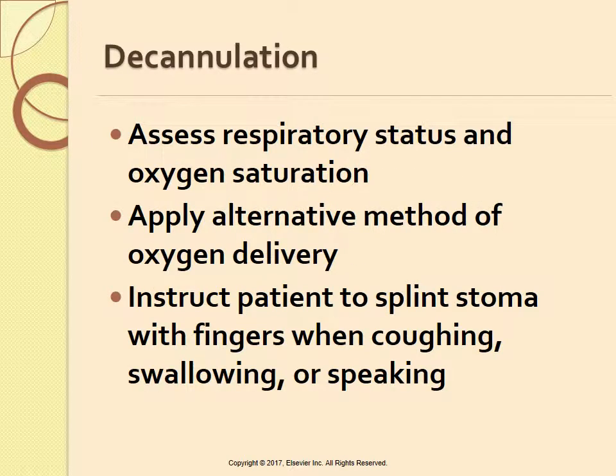Monitor the patient's respiratory status and oxygen saturation for any evidence of air compromise. Apply an alternate method of oxygen delivery if required. Instruct the patient to splint the stoma with fingers when coughing, swallowing, and speaking.